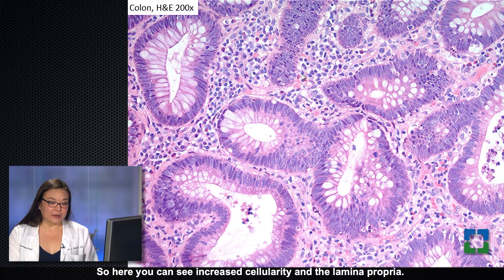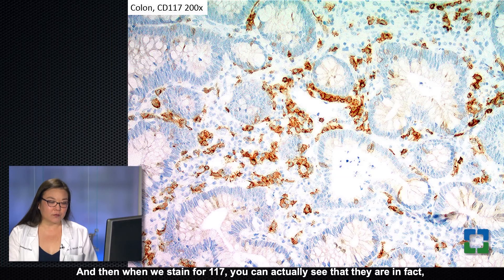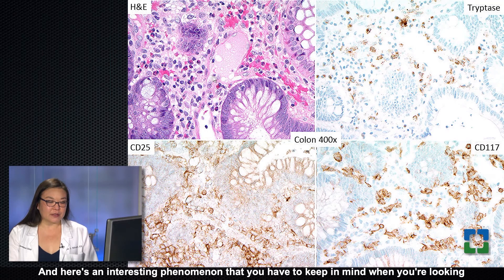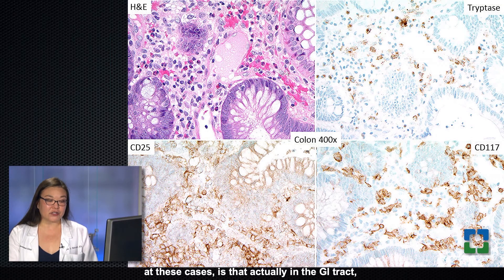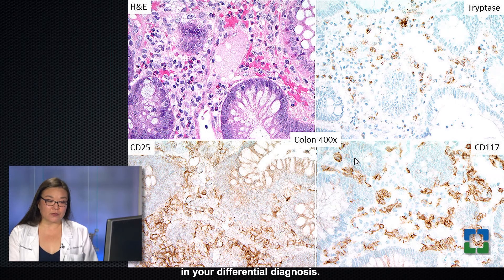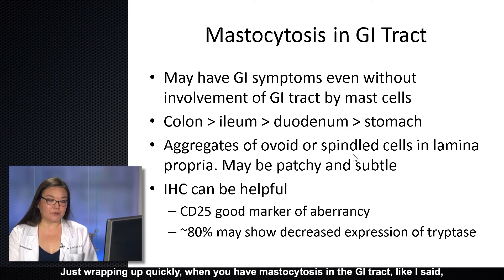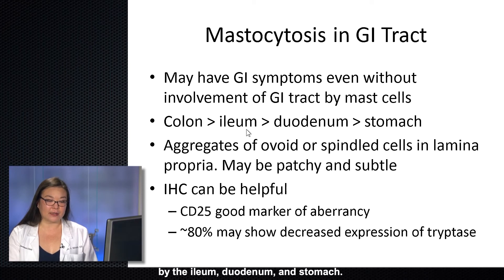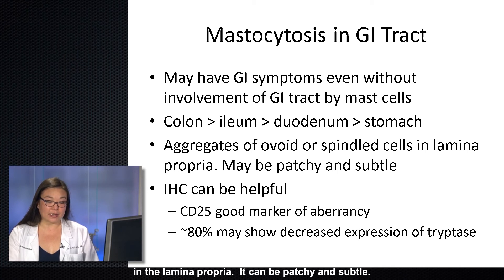He was having diarrhea, and that is something you can have with mast cell disease because of the inflammatory mediators that are released, but you can also have direct tissue involvement. In the colon biopsies, you can see increased cellularity in the lamina propria. When we stain for CD117, you can actually see that there are scattered mast cells aberrantly expressing CD25. It's important to note that in the GI tract, mast cells tend to underexpress tryptase, so you want to be sure to do your full panel of immunohistochemical stainings if mastocytosis is in your differential.